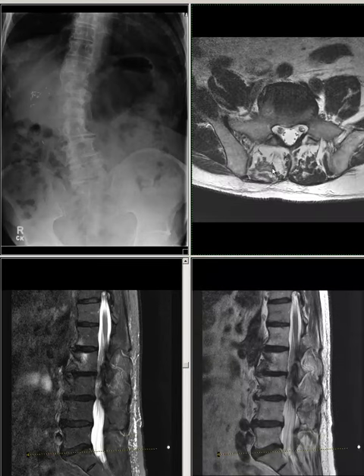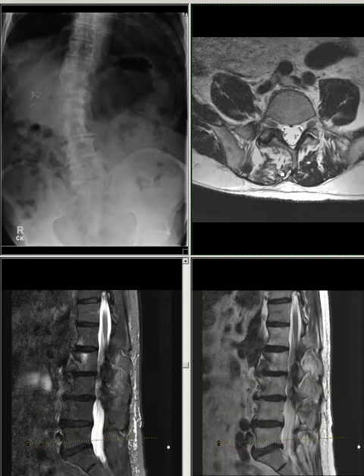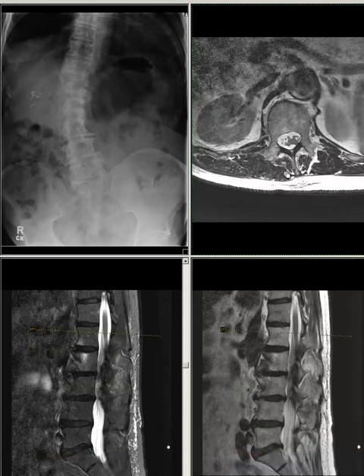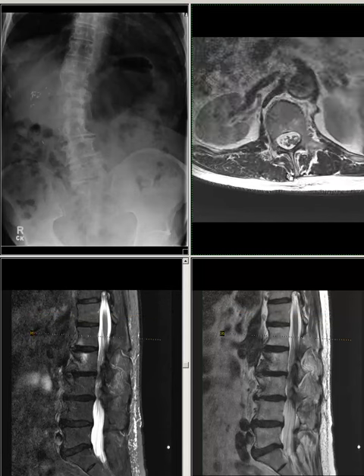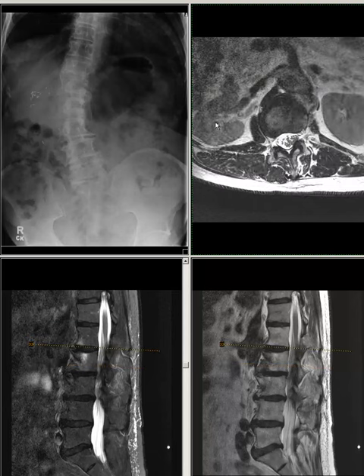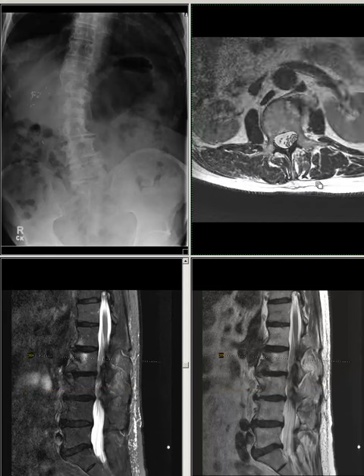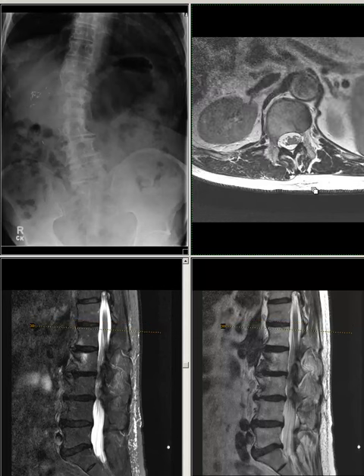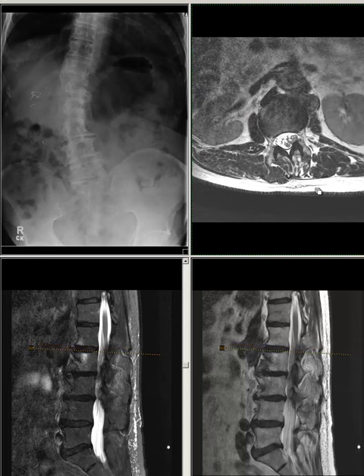There is fatty atrophy of the right side paraspinous muscle at L4 and L5 levels. No evidence of retroperitoneal lymphadenopathy. The visualized bilateral kidneys are unremarkable. T12-L1: There is disc desiccation and bilateral facet joint hypertrophy. L1-L2: There is disc desiccation and bilateral facet joint hypertrophy.